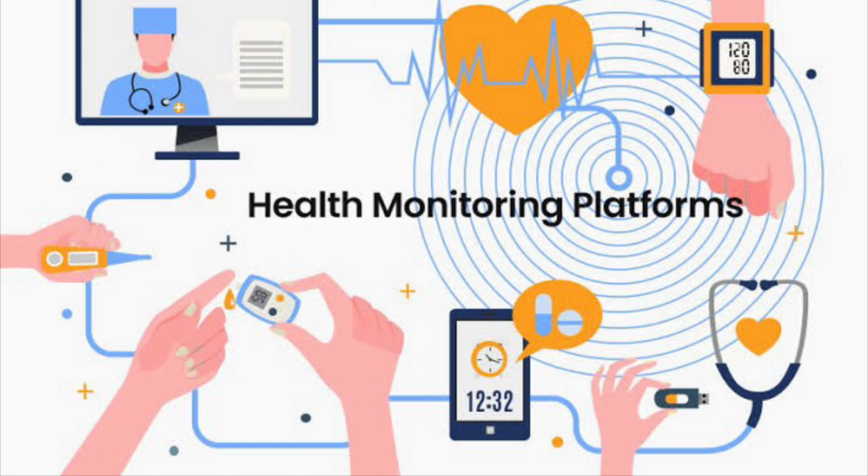The second could be to add new revenues, and the third could be if you want to reduce the workload of the nurses, or you want to project an image for the hospital that this is high tech, or this is something which you want to implement in the hospital so that the perception of the patient regarding the technology and the patient care improve. So once you have made clear the purpose of the program, it'll be easy to form the team. That is the second step, which is forming the team.